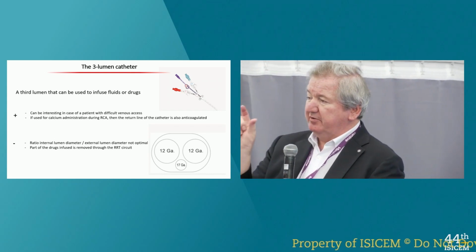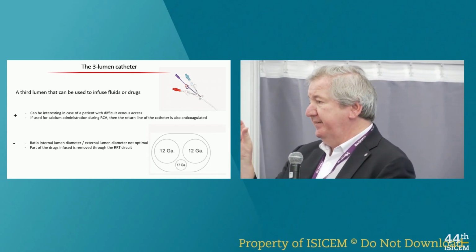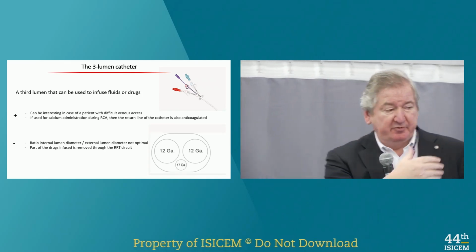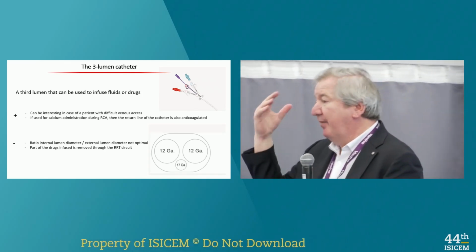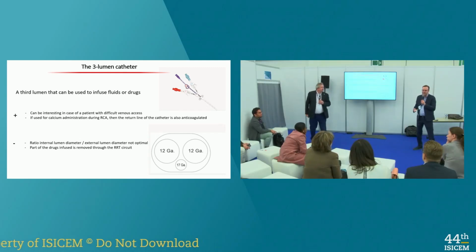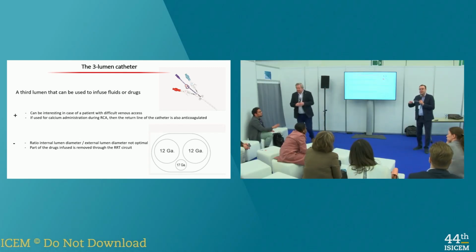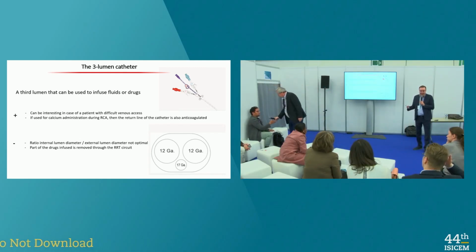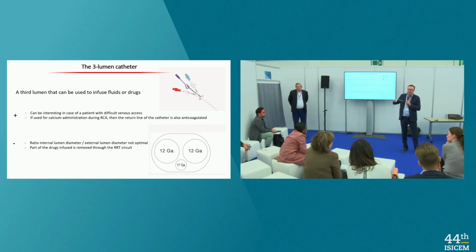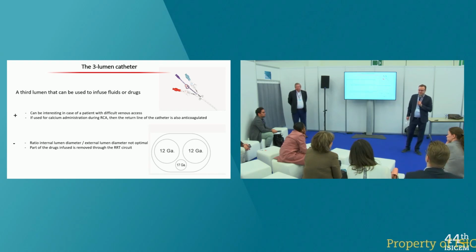But you have to make sure on the chest X-ray that there is a difference of 3 to 4 centimeter to repeat the shotgun approach. Okay? But I've seen also in some centers, not in France actually, but abroad, and again in UK, sometimes they place both lines, the dialysis catheter and the central venous line, in the right jugular vein.